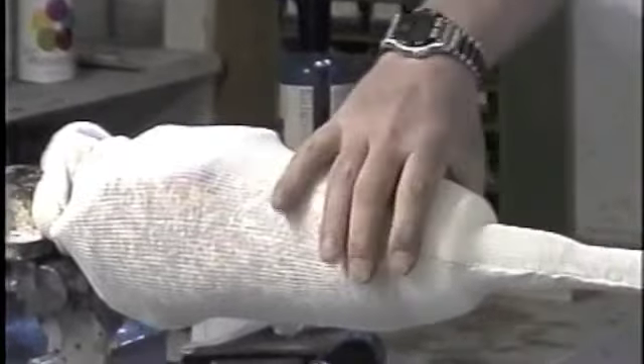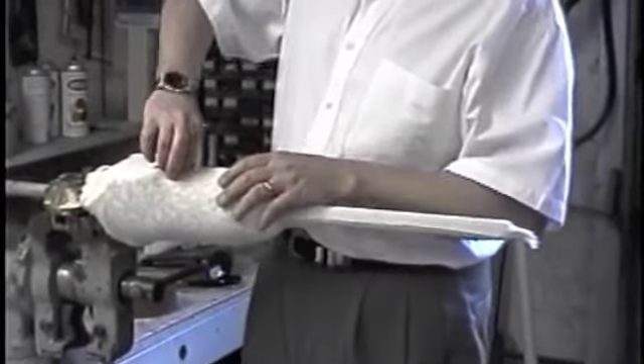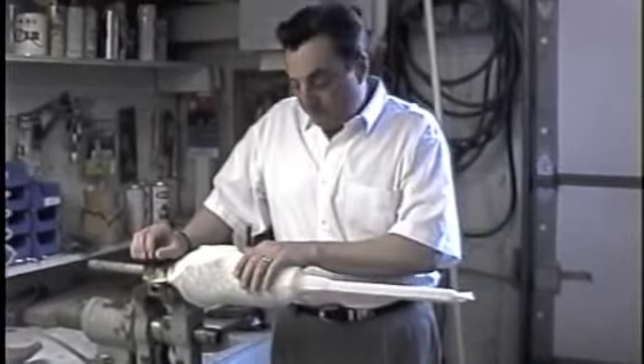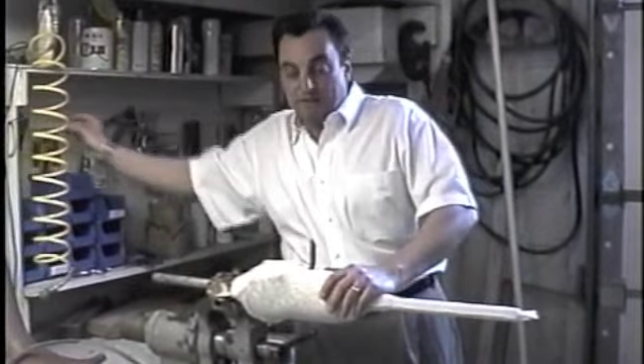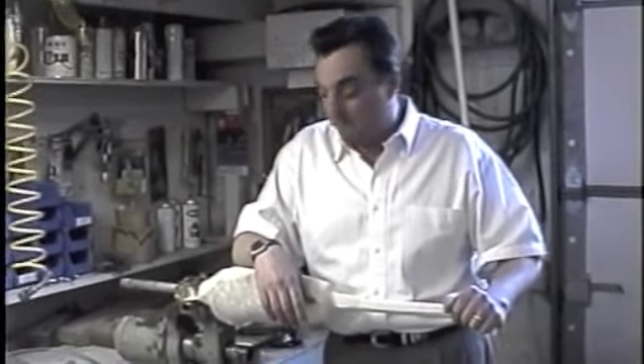There are two reasons to keep the lines straight. First, the project looks nicer. Second, because this prosthesis requires anywhere from 2,000 to 3,000 pounds of force to remove — the straighter the lines, the easier it's going to be. The reason we use cotton stockinette is one of the biggest secrets of the endoflex prosthesis: we use cotton stockinette wet to do our vacuum forming. Water is an excellent mold release for thermoplastic materials — and it's free. Cotton will absorb moisture much better than nylon, perlon, or any synthetic material.